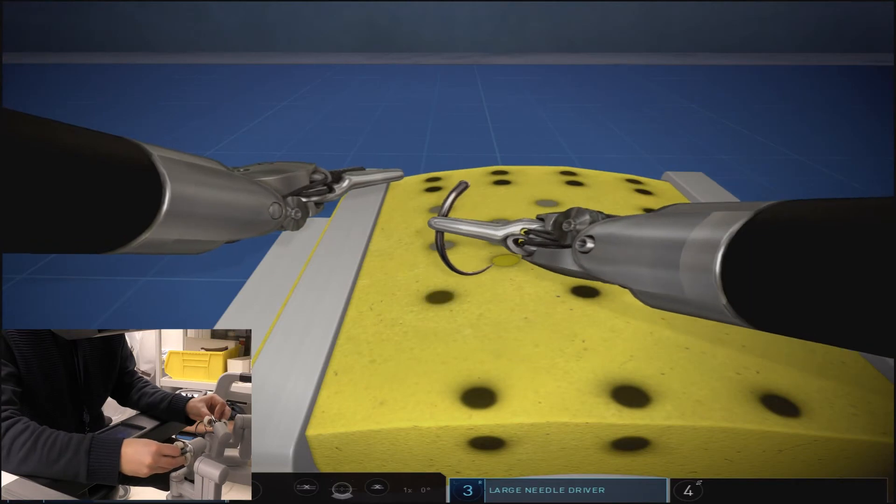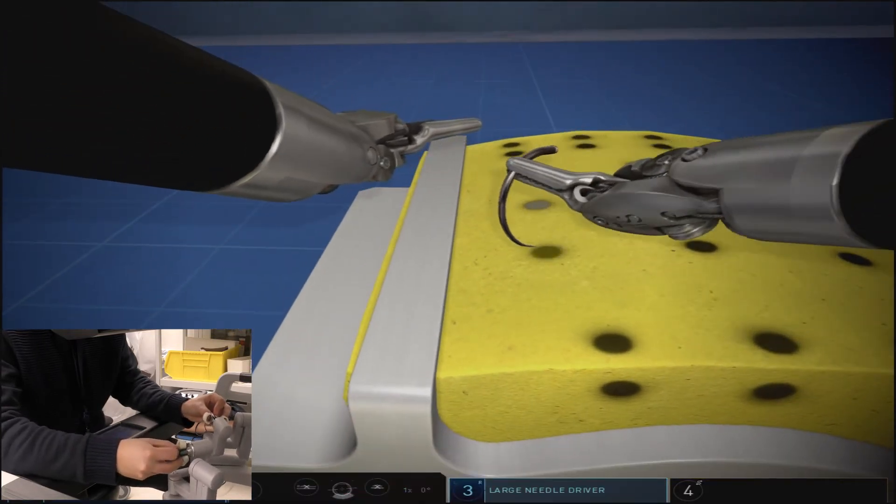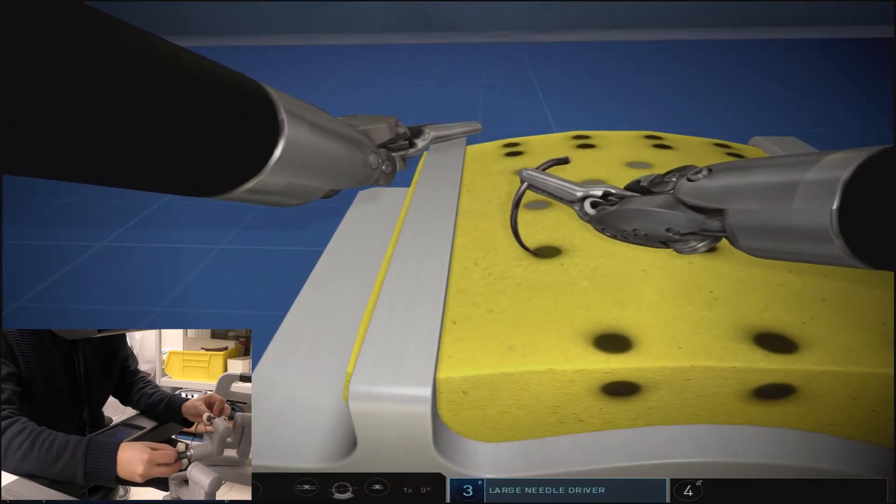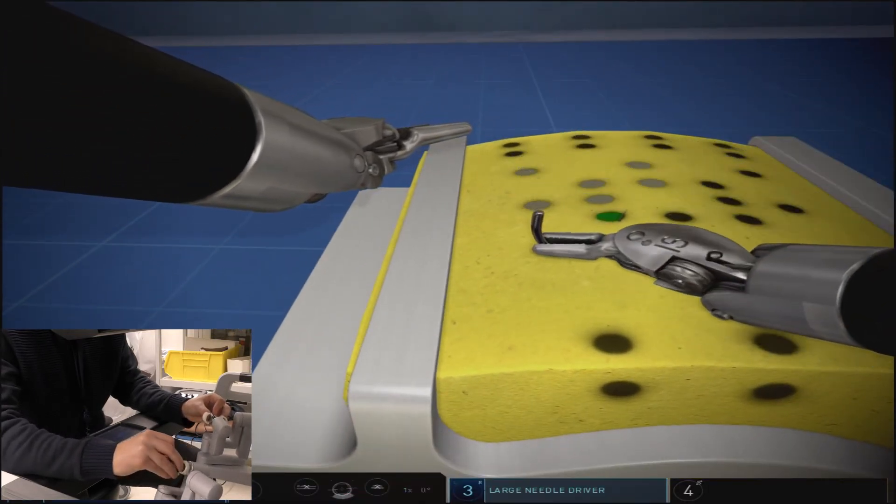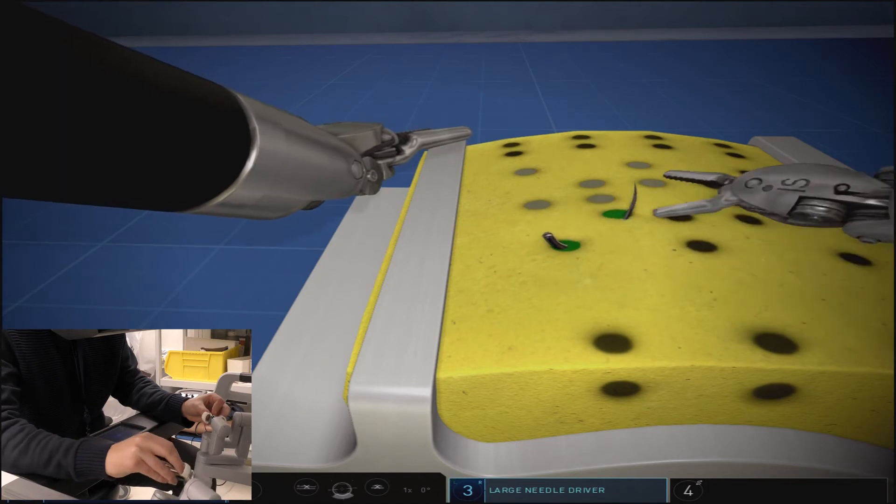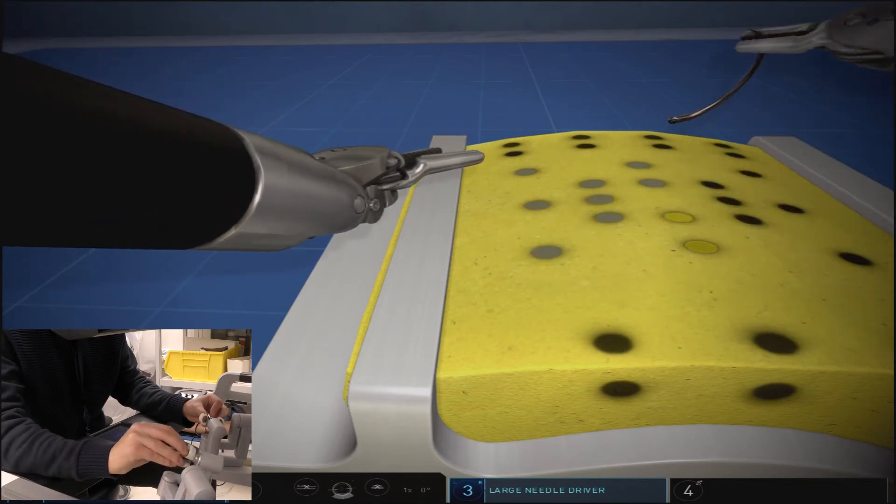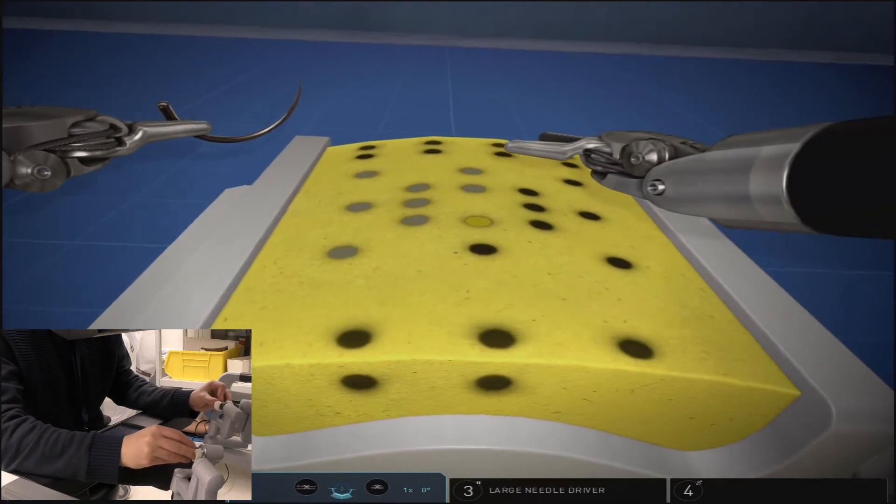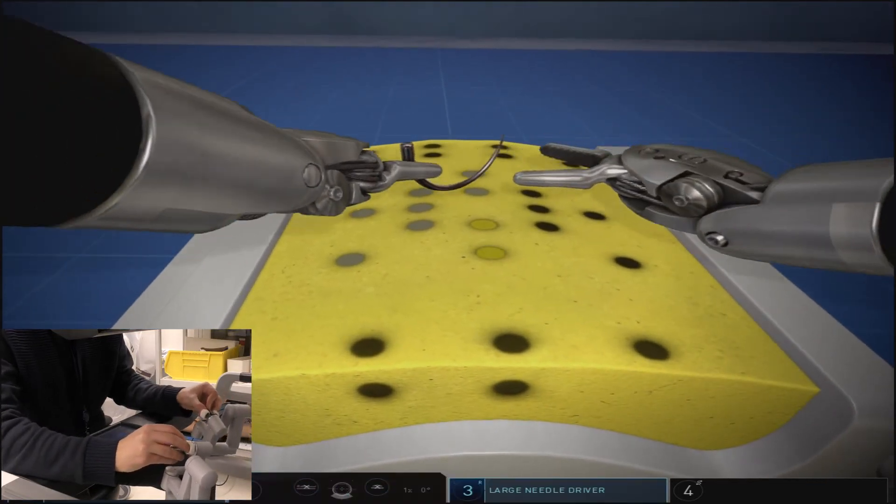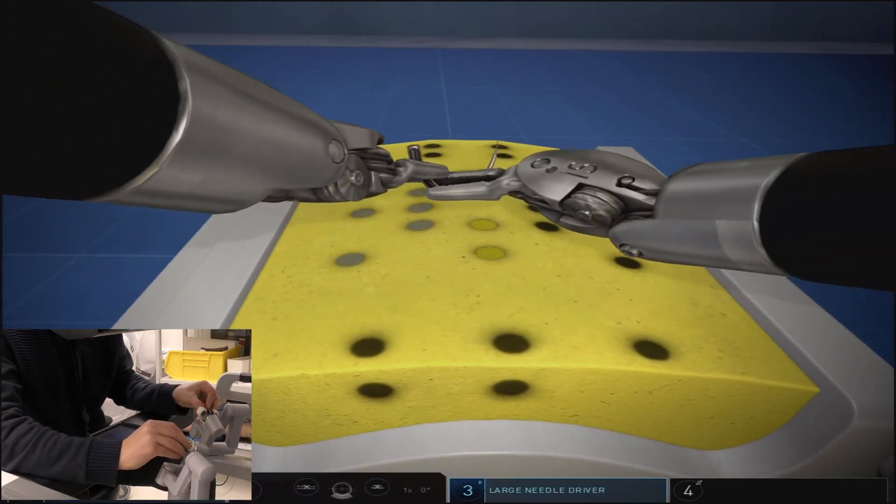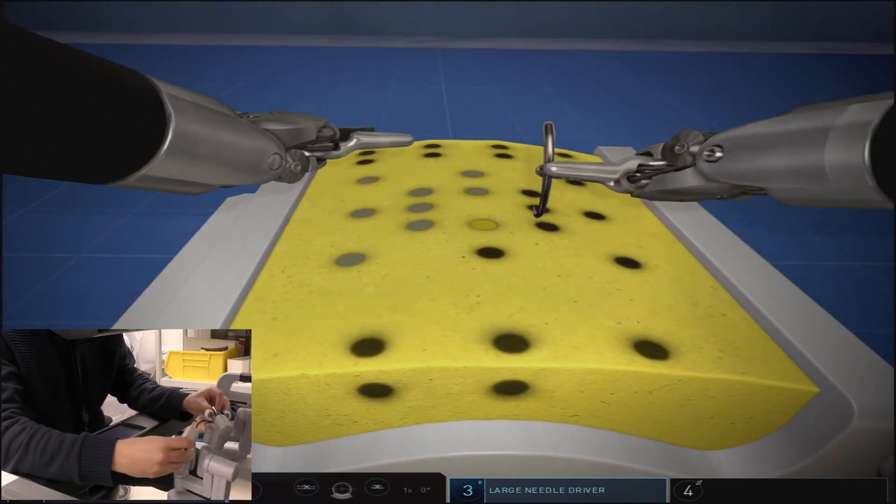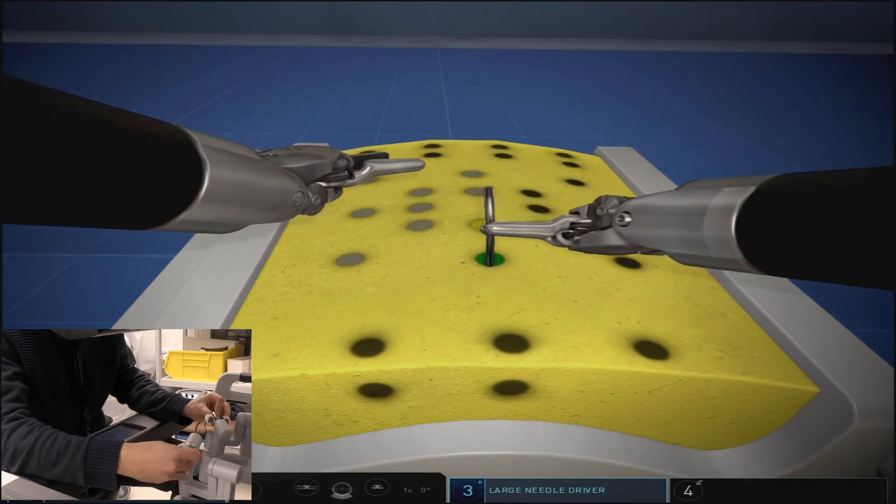You can see that based on the orientation of the throw we are alternating between the left and right needle driver, and this is where knowing how your wrist articulation works and planning your next throw is important and vital to moving swiftly through this exercise.